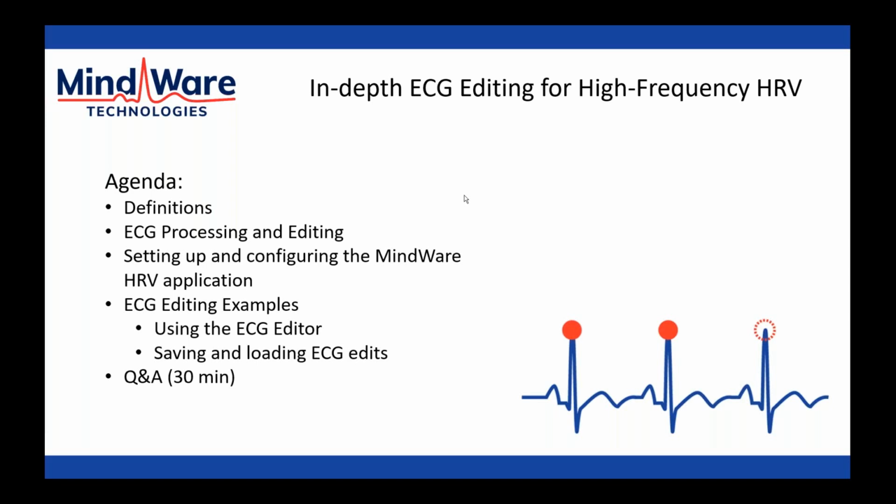We're going to be talking about a lot of editing techniques today that would apply to any ECG editor that you're using, whether it's a MindWare tool or not. But given this is a MindWare webinar, we're going to be using the MindWare HRV analysis application to demonstrate the various techniques that I'm going to talk about.